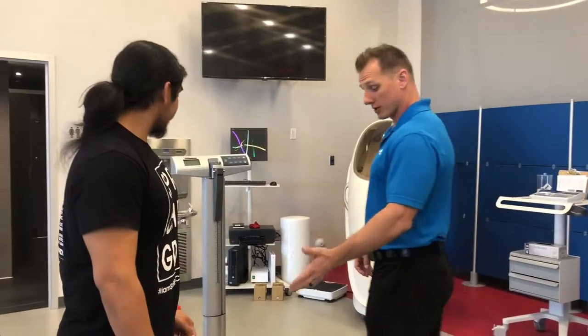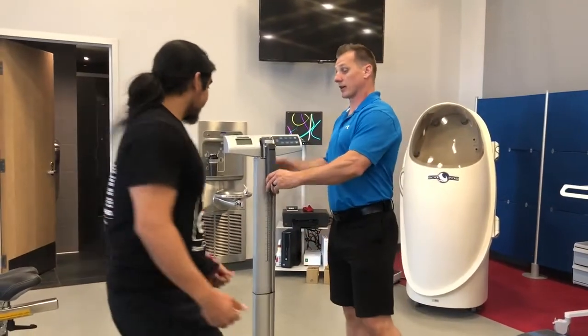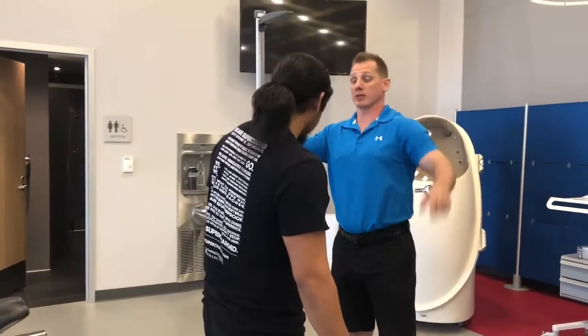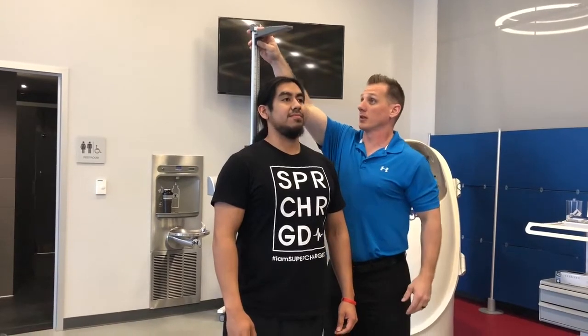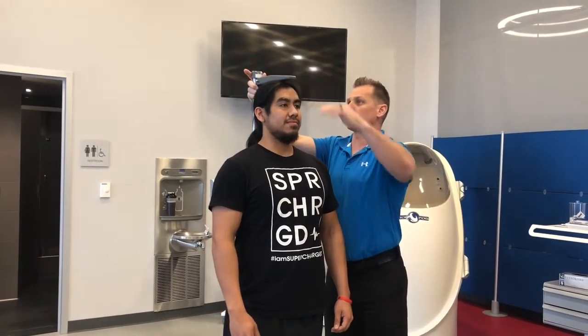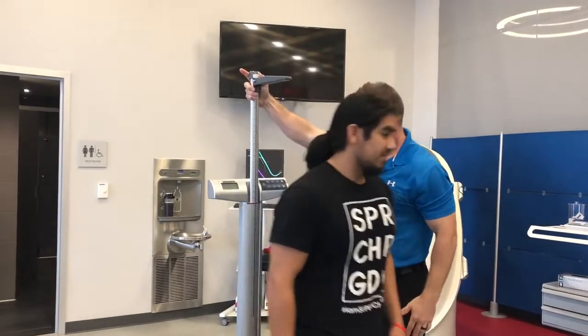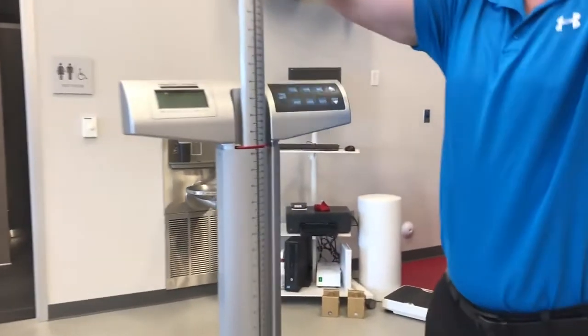All right, Darius, I'm going to take your height. The first thing I want you to do is take your shoes off for me, please. I'm going to have you step on the scale, and I'd like you to actually face away from the scale. Go ahead and take a little step back, stand straight up, tilt your chin up just a hair. I'm going to move your hair to the side so I don't pinch it in the scale. Go ahead and step straight out. I have you at 66 and three-quarter inches.